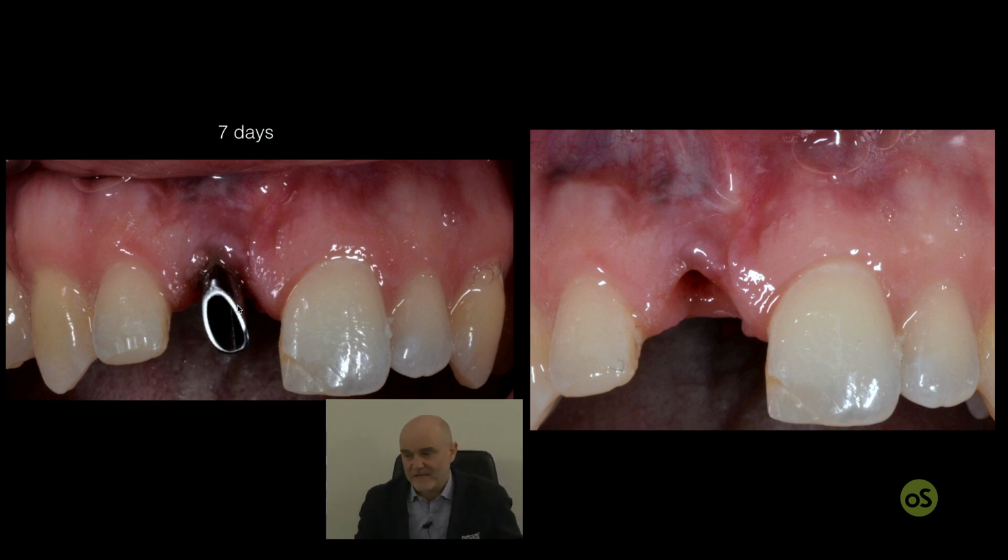And over 6 months, if the zirconium is too thin, you have risk of fracture. So sometimes you cannot work with a zirconium abutment, and I tell you that most of the time, the worse the implant is placed, the greater is the possibility that you only have a metallic abutment, so that you can keep the metal as thin as possible with respect to the screw, and this abutment as narrow as possible with respect to the head of the implant.